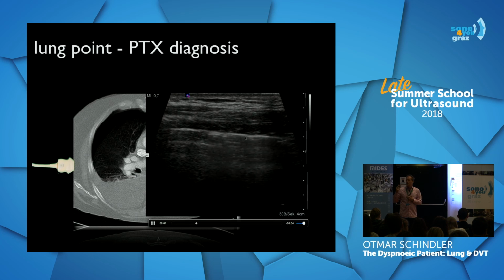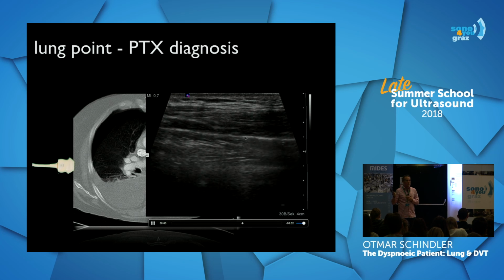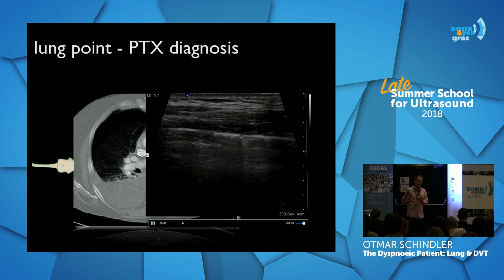Do we always find the lung point? No, that would be too easy, huh?